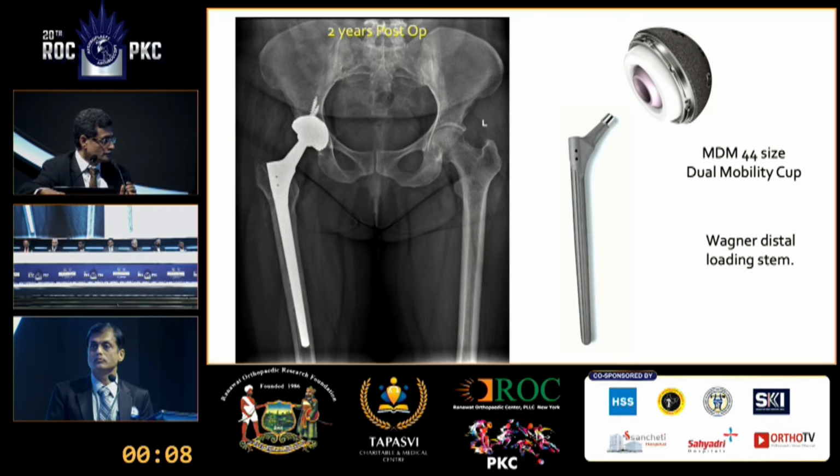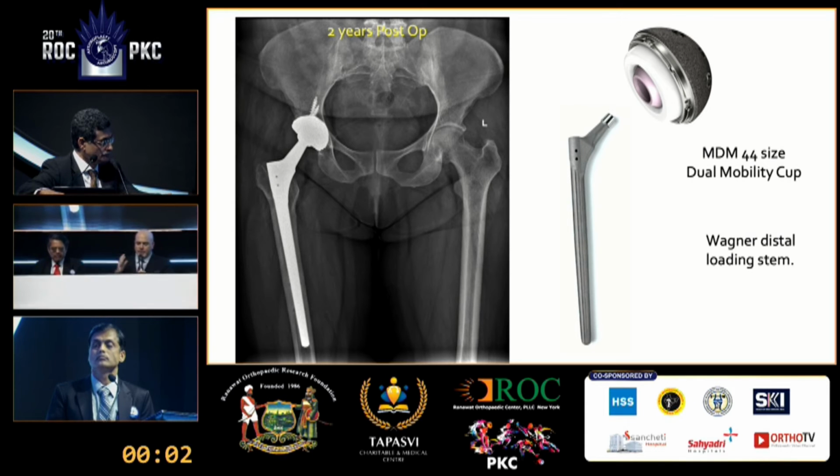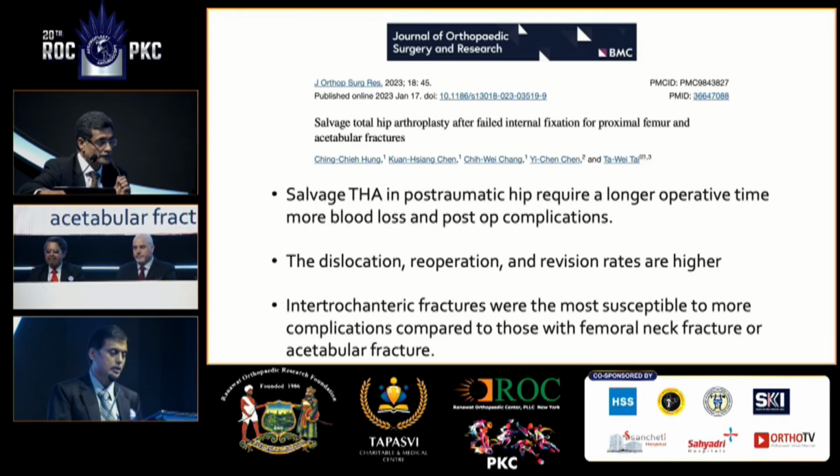The point I want to make is you don't have to bypass. We've put it into your heads that this person has good bone. You can go short stem and put a plate on the outside if you really are nervous, or just keep them on crutches for 6 weeks. After 6 weeks, that is mitigated. So bypassing things, I think sometimes we spend too much time. You need to weigh the risks of bypassing something versus just going shorter. Okay. Thank you, Rajkumar.